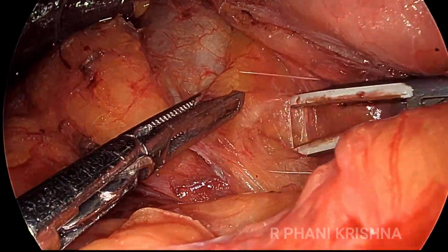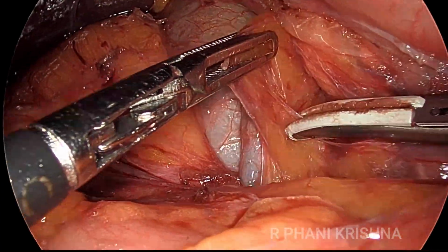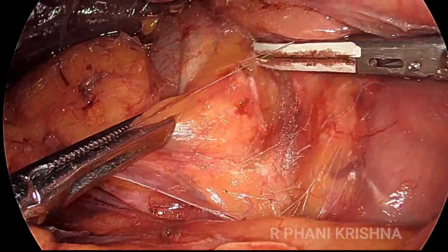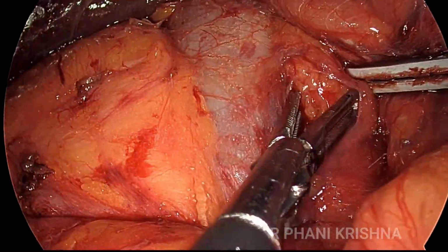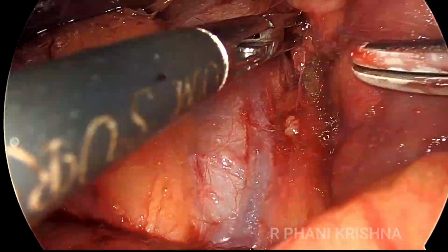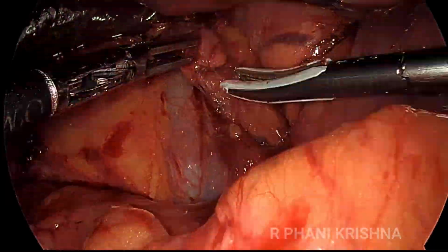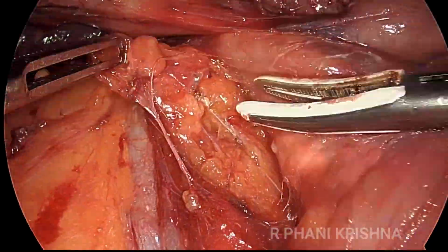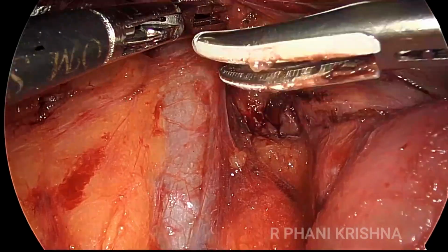And once we do the Kocherization, we identify the aorta, the groove between the aorta and IVC, and the retroperitoneal chain of lymph nodes in this part is being sampled. Just make sure that, especially the IVC, you dissect it well and avoid any injury to the IVC during this part. And these lymph nodes are being dissected and sent for frozen section.